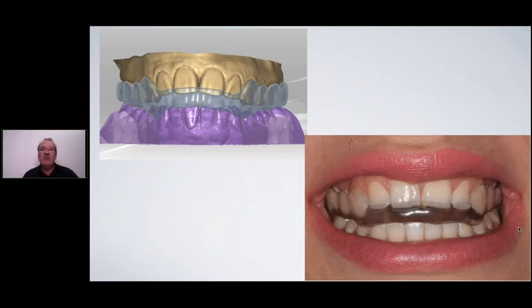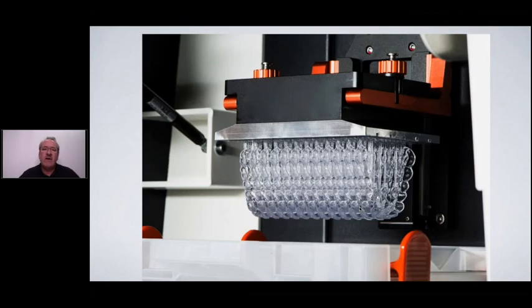Basically, it always fits. You can also adjust the undercuts, so you can say, I want it fitting tighter, I want it fitting looser. We don't have this when we try to mill it. So here we're using a material from Dentax, which has been proven excellent, or from Shofu even. And sure, you can make all kinds of trays, different variations, and print lots of them.